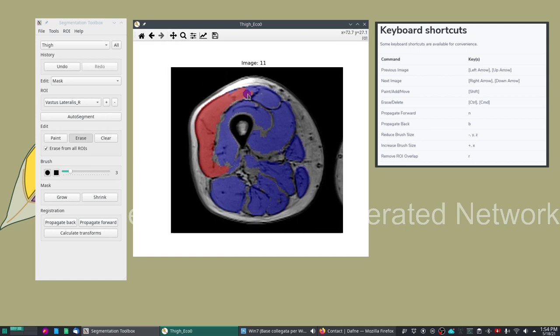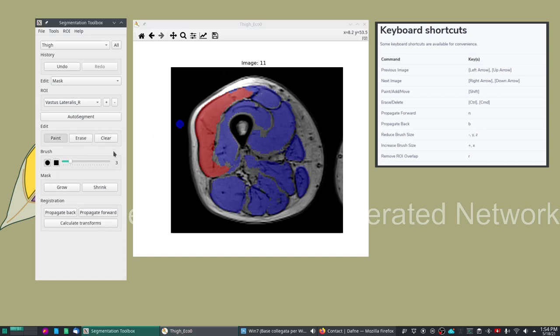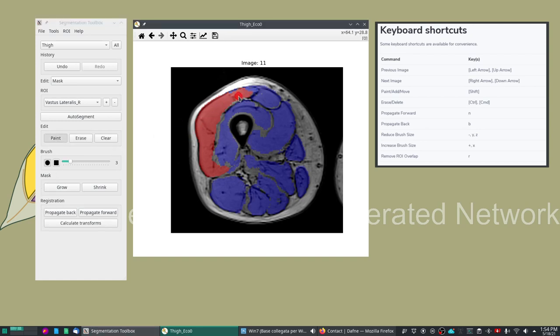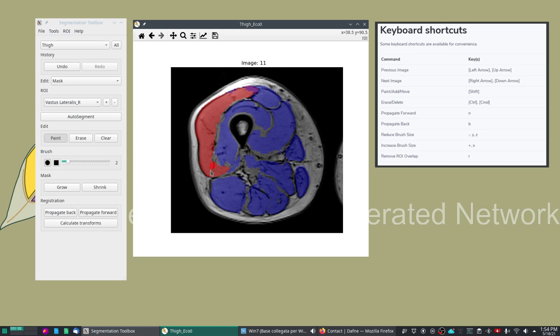For example we'll do this. The vastus lateralis actually goes all the way here so let's move to paint. Some portions are misclassified as other muscles so we want the vastus lateralis to include also these areas that were misclassified.